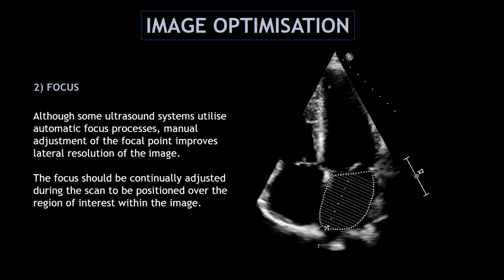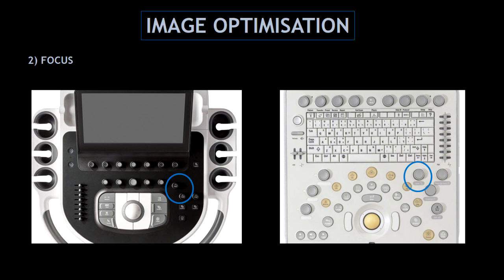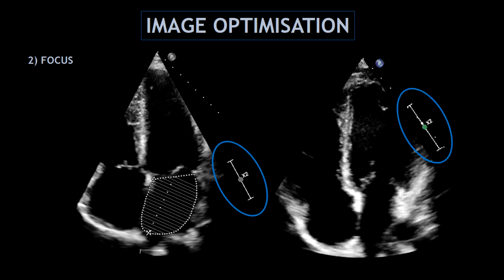Our next feature is the focus. Even when some systems utilize an automatic focus, manual adjustment of the focal point improves lateral resolution of the image. The focus should be continually adjusted during the scan to be positioned over the region of interest. On the left side we have the Philips Epic and on the right side we have the Philips CX50 — in both keyboards, the focus button is on the right side. Here I'm showing you how I move the focus during the scan: on the left side I'm adjusting the focus to concentrate on the left atrium, and on the right side, I'm adjusting the focus to concentrate on the left ventricle.